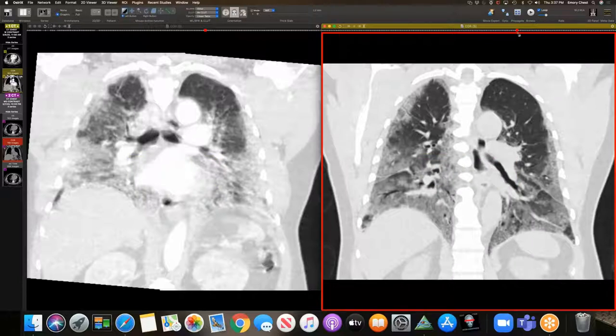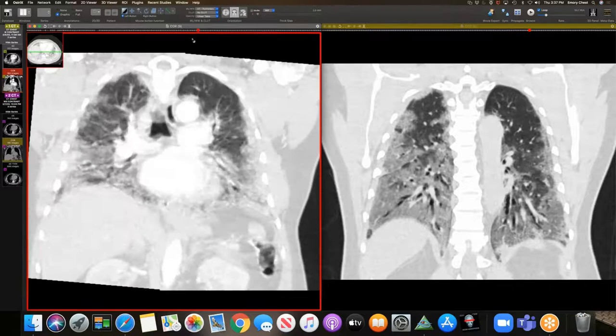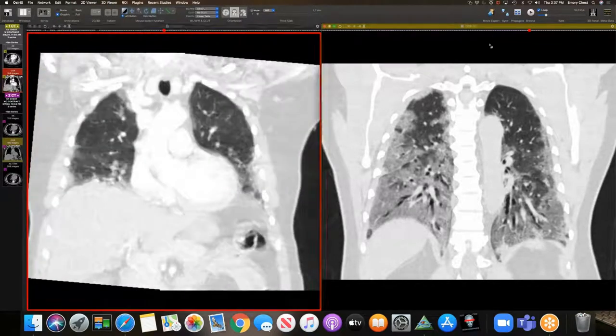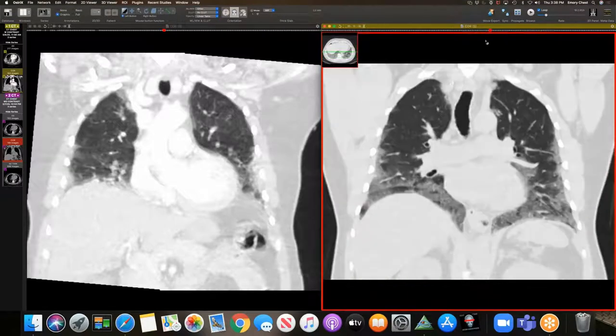Well, it's hard to say, Seth, because the patient on the left-hand side may have been feeling really sick and unable to take a deep breath and dyspneic. Right. Yeah, but even if you ventilate these patients on high pressure, their lungs won't get much bigger than this. I agree the patient could be on expiration, not breathing well, but to me this looks like bad lung injury progressing to worse lung injury, to DAD. At least that's what it looks like to me.